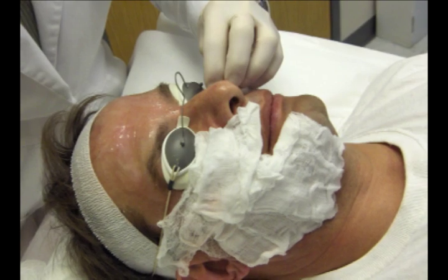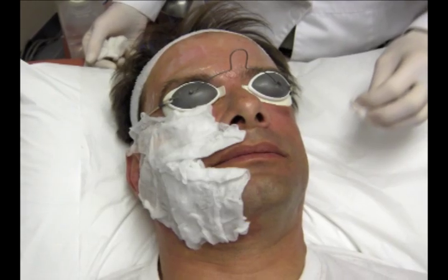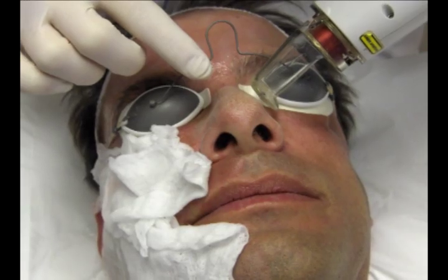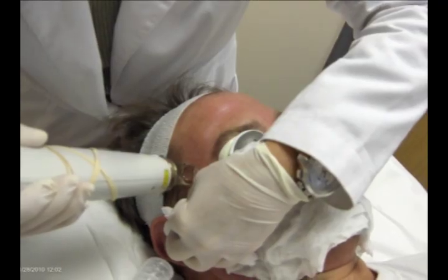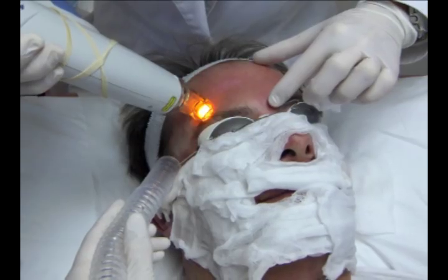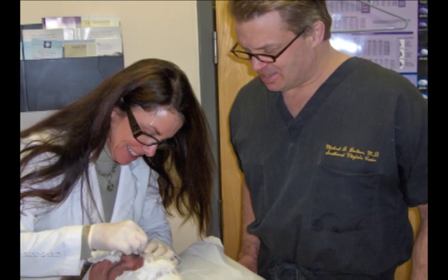Fractional erbium resurfacing stimulates collagen. It removes those little columns of skin. So you not only get the benefit from the ablative erbium fractional by resurfacing the outer layer of the skin and removing the stratum corneum, but you also get the benefit of the collagen being rebuilt by the thermal damage that the laser creates by boring those little holes in your skin. You're going to continue to get results for the next two to three months with an erbium fractional laser — an ablative treatment.